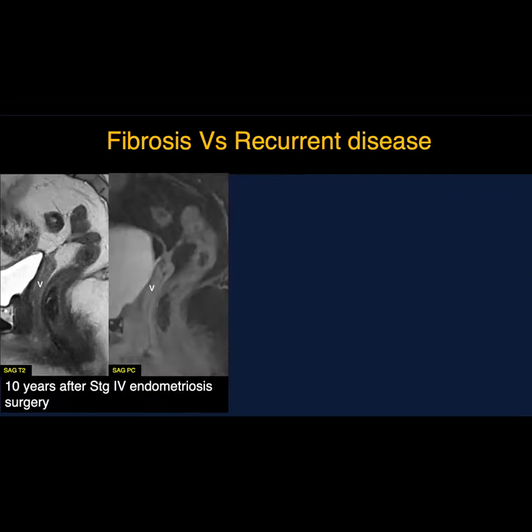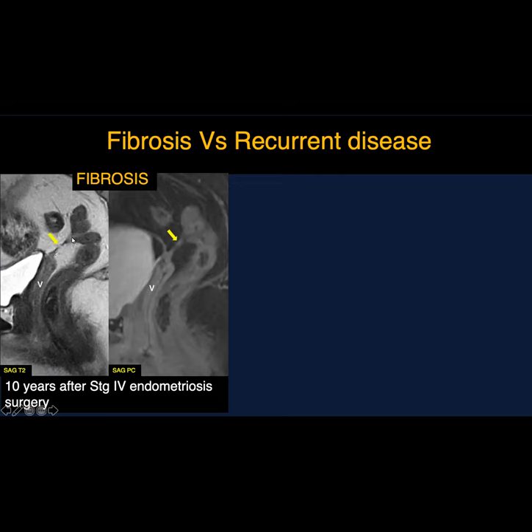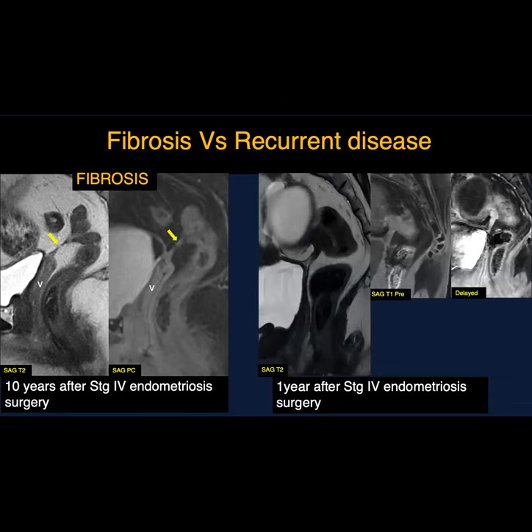Moving on to how to identify recurrent disease from fibrosis. Here are sagittal T2 and post-contrast images in a patient many years after stage 4 endometriosis surgery. You can see a thin T2 hypointense fibrotic band bridging the vaginal wall to the anterior rectal wall with delayed post-contrast enhancement, a little tethering of the anterior rectal wall, but not a lot of distortion of the pelvis. This is merely fibrosis, and fortunately this patient has been asymptomatic.